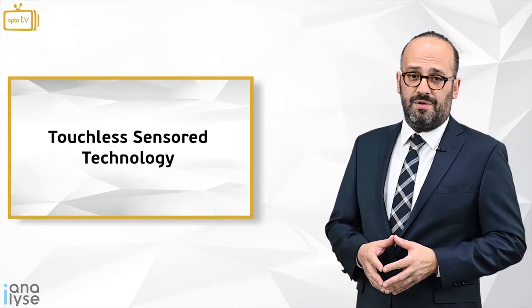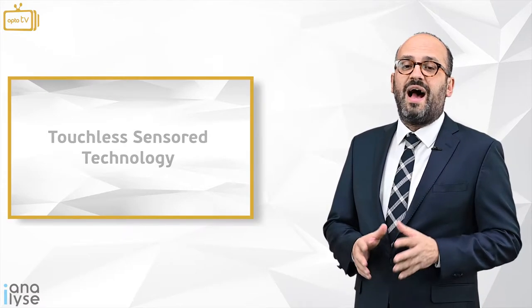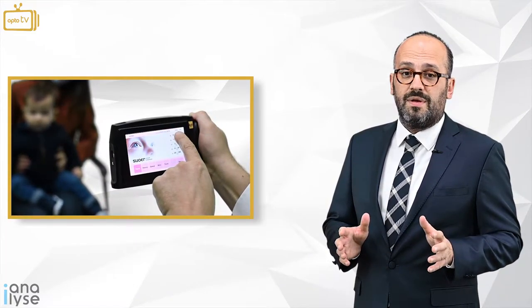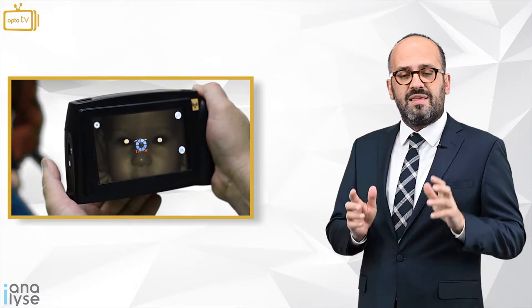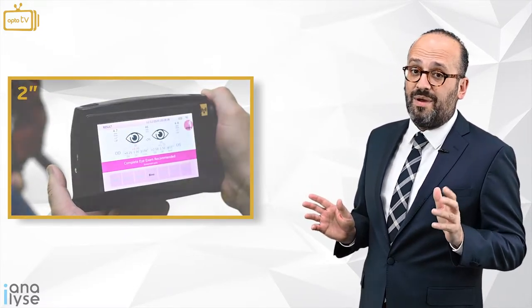First, the SW800 vision screener uses touchless sensor technology, which allows you not to be distracted by buttons or green bars. You simply lock the pupils of the child or adult on your monitor, and then in two seconds you can capture eight measurements.